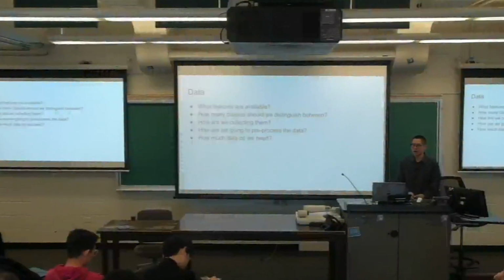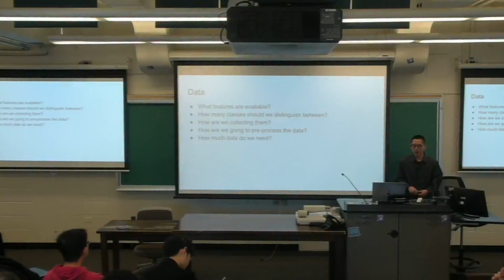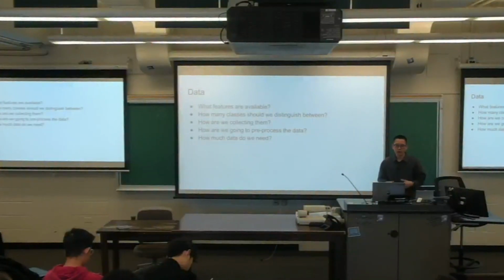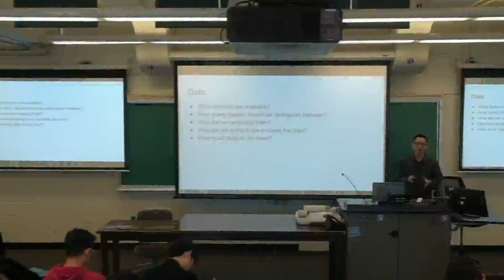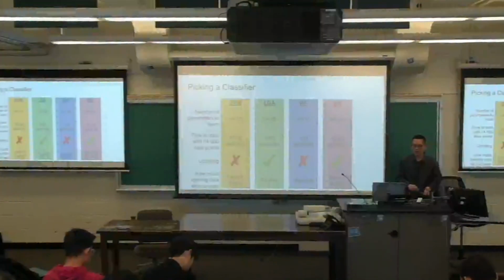Of course, for any machine learning application, the more the better. But in our case, I want to point out that we are very limited by the real-life constraint because it's very, very hard to collect enough data on stroke subjects. So we have to keep that in mind. And in fact, this is going to be a main challenge throughout the whole line of research work, which is we need to handle the data scarcity. Right, so that's the data side.